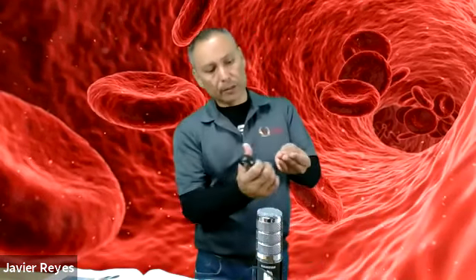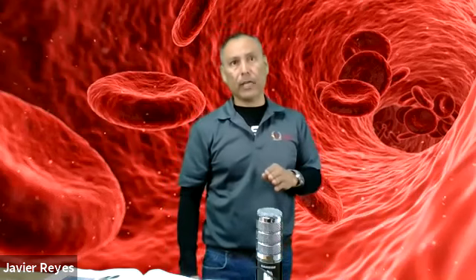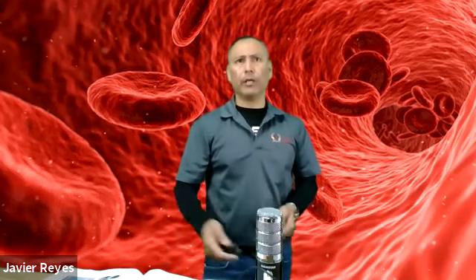After you puncture the site with your lancet device, make sure you wipe off the very first drop of blood. Why? Because that first drop of blood is considered contaminated. We don't want that in our sample. So make sure you wipe that first drop of blood. Make sure you have gloves on, of course. Your equipment should be ready right next to you within reach. Select your collection devices and start collecting your specimens.